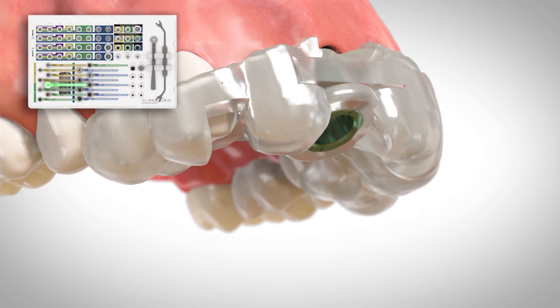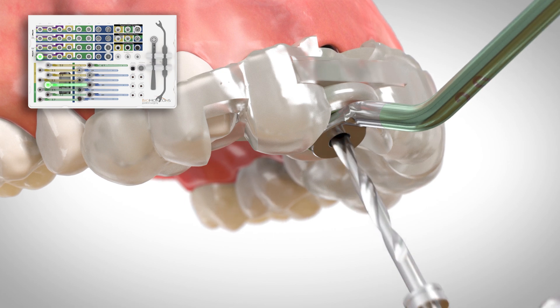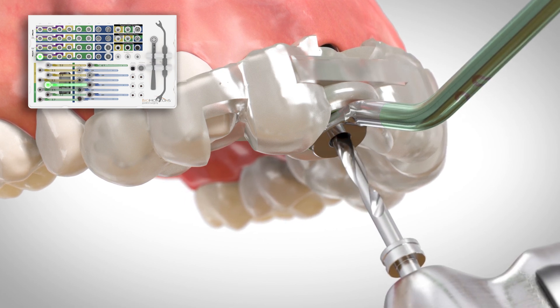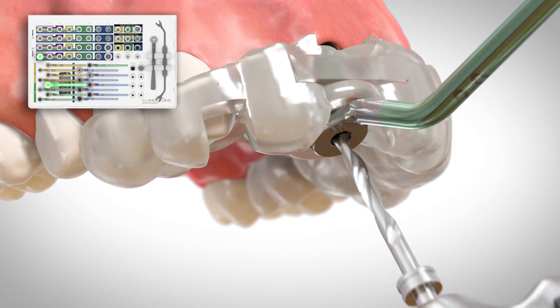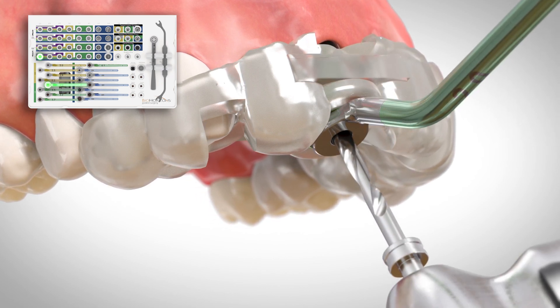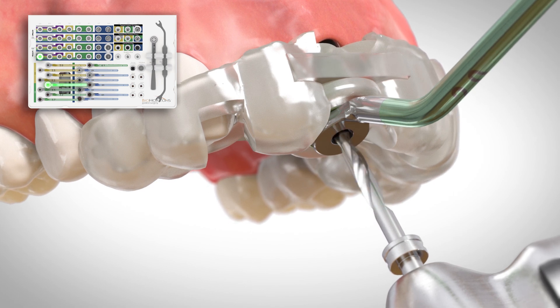Place the drill guide into the master cylinder and advance the pilot drill through the drill guide until it rests on the bony crest. Confirm passive seating of the drill by pumping the drill in and out. Once the drill is passive, rest it against the bony crest and begin drilling.